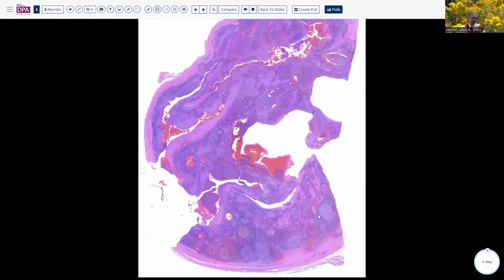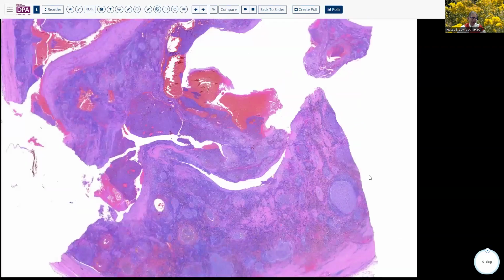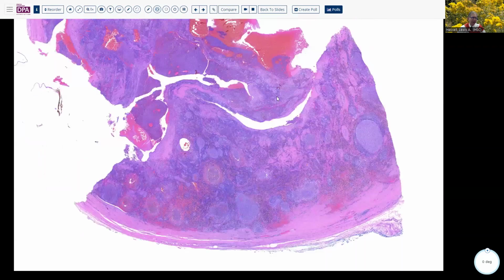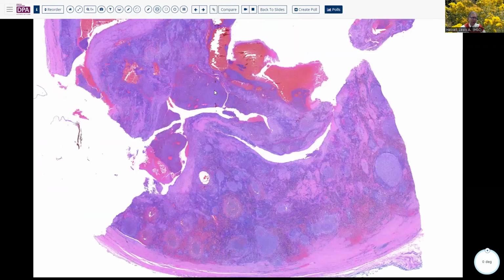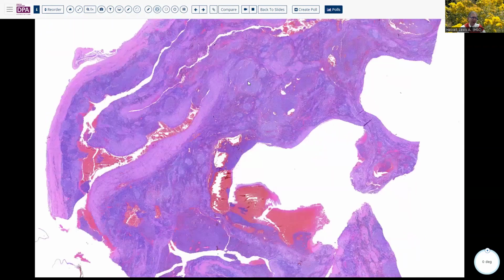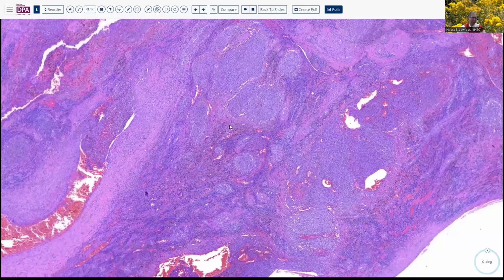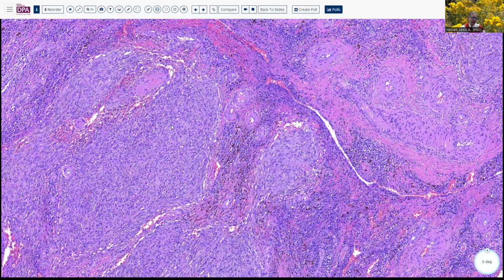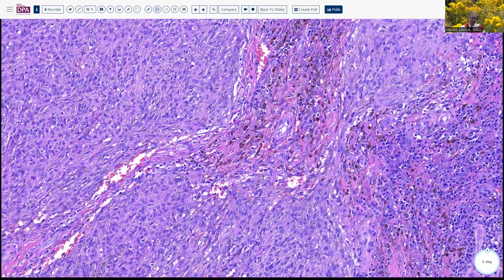A similar lesion, similar features that we emphasize: the fibrous capsule, the sort of pseudo-telangiectatic or ectatic cystic type spaces, and then these somewhat nodular epithelioid to slightly spindle-shaped cells, intervening vasculature, and moderate amounts of hemosiderin potentially being present.